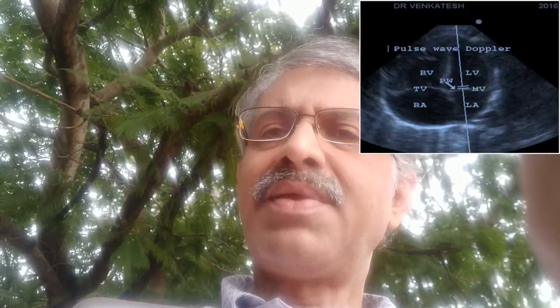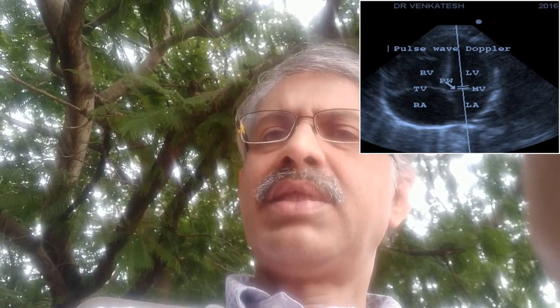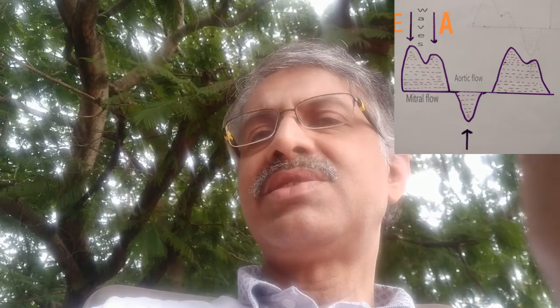Identify the mitral valve and the pulse wave Doppler gate is kept just below the annulus of the mitral valve. You get this E by A wave. This E by A wave is the positive deflection you see.